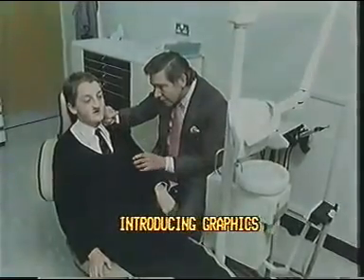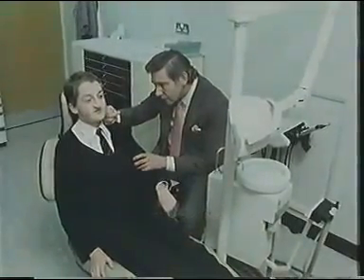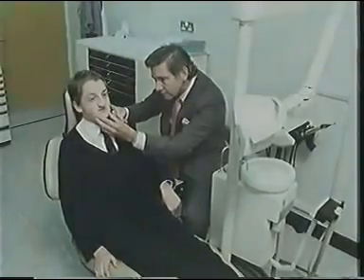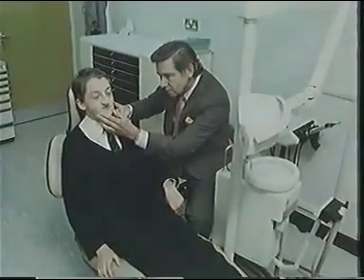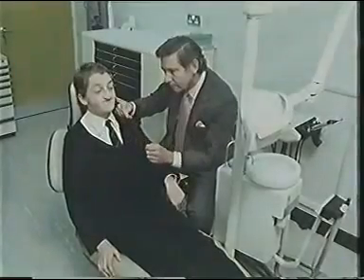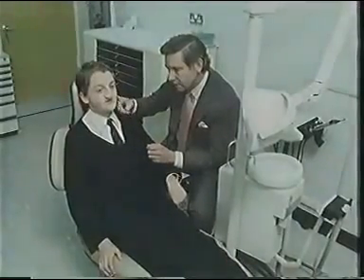Do that slowly. Now relax. Relax your jaw. Computers have been used in medicine for a long time. But here in University College Hospital, they're developing a new and unusual application. This patient has a badly formed jaw, which is going to be corrected by surgery.